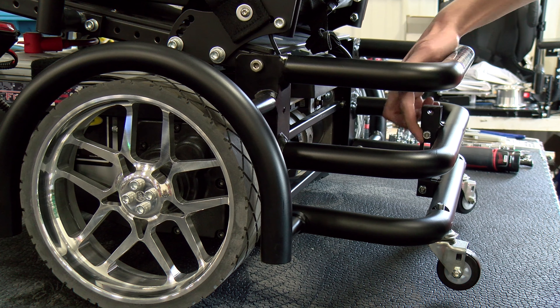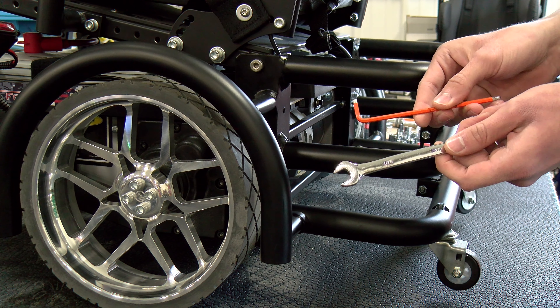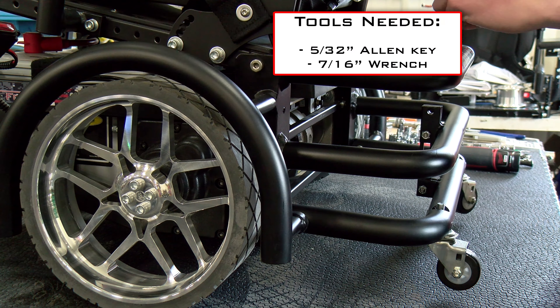First we're going to take out the two shoulder bolts holding in the anti-tip bar linkage. To do this you're going to need a 7/16 inch wrench and a 5/32 inch Allen wrench. You can also use a socket wrench to speed up the process, which is what I'll be using.